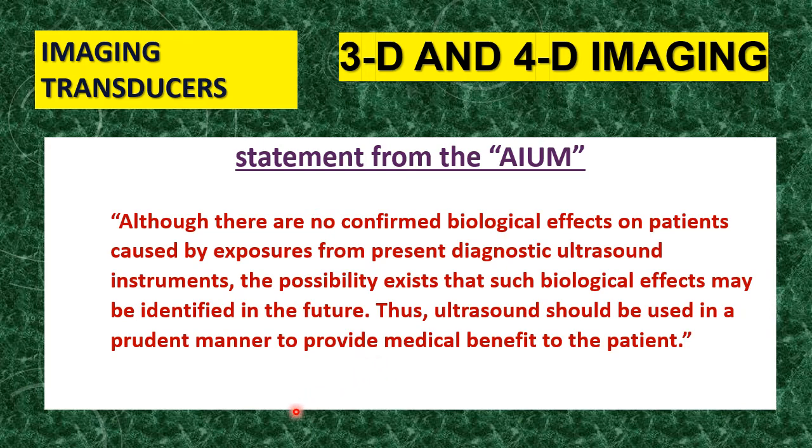Although there are no confirmed biological effects on patients caused by exposures from the current diagnostic ultrasound instrumentation and machine settings, the possibility still exists, because there are no reported cases, that such biological effects or bioeffects may be identified in the future. Thus, ultrasound should be used in a prudent manner to provide medical benefit to the patient. Not for fun, guys.